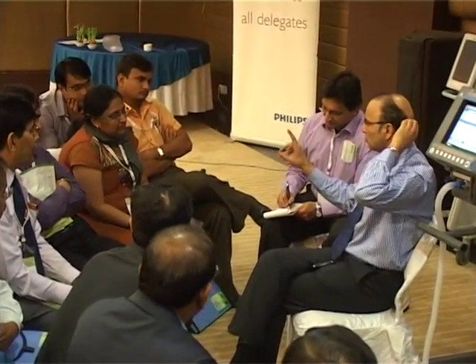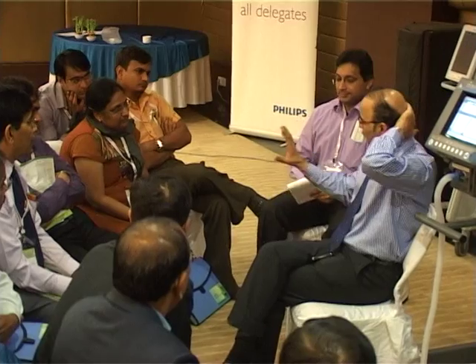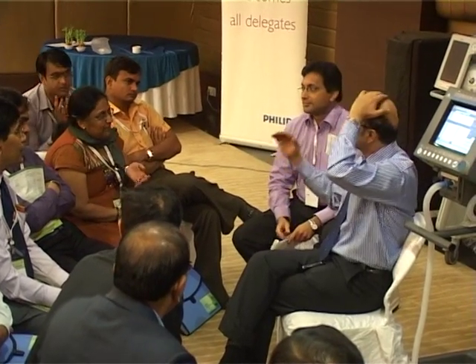Don't use the word spontaneous loosely. In assist control, the patient is of course triggering, with backup ventilation. The only difference is that the patient can initiate, and the rest the ventilator takes.